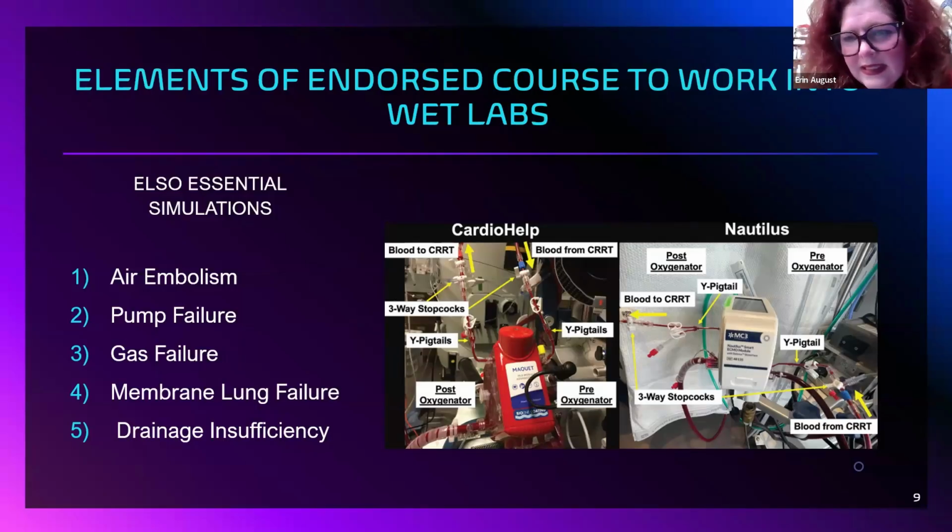And do you adapt these things into your program, that maybe I don't want to just change the oxygenator when the oxygenator is bad, when my PaO2 post-oxy goes down. Maybe for me or my team, it's better to change the whole circuit, even when you know there's an inflammatory response, but risk versus benefit for the patient. Would I cut in a new circuit that takes 30 seconds versus do I cut in an oxygenator that may take me 1 to 2 minutes, depending on your situation?